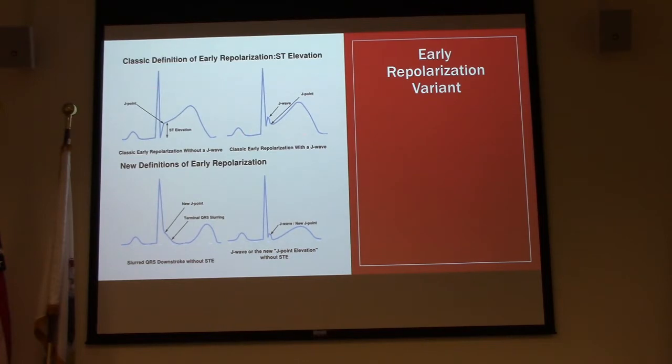The other thing that we're looking for now is the J wave, and it's this little notch. It starts to come down, and before it can make its way back down to the isoelectric, we see this little hiccup, or this little notch. That notch is telling us that the heart is trying to repolarize earlier than it should. And like I said, for the most part, it's not a big deal, especially in our younger people. Other definitions you'll see here, if you take a look, it's got this nice little notch coming down. It doesn't quite make it, and it does a little hiccup or this little notch right on top.